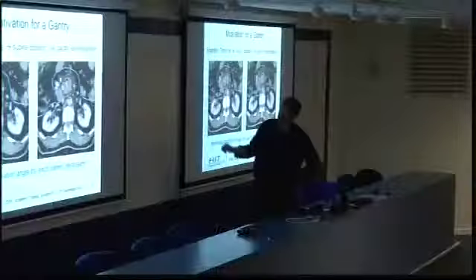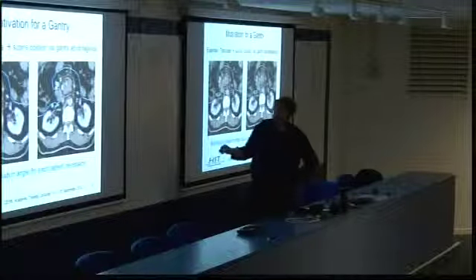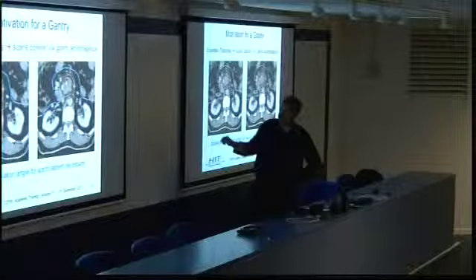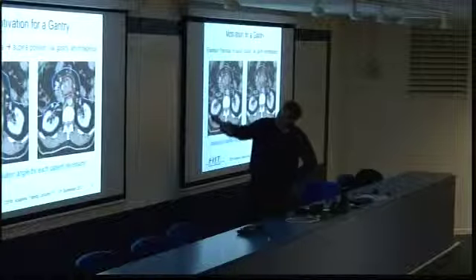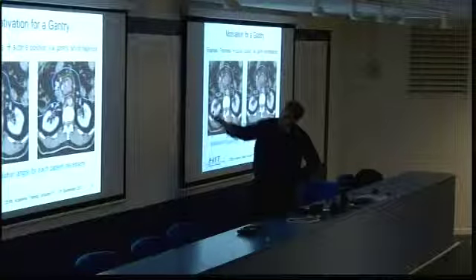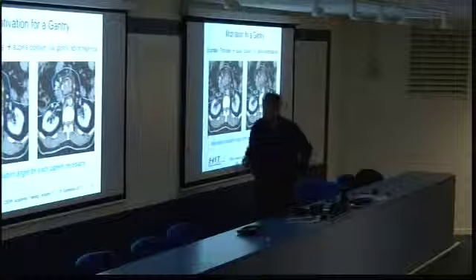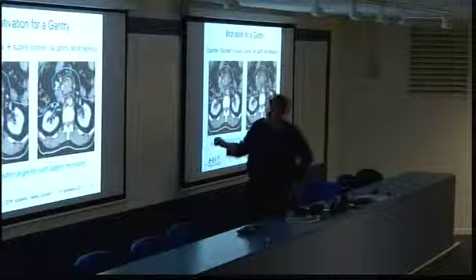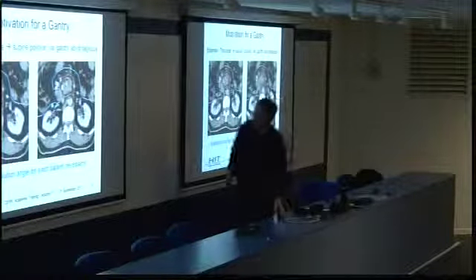If you want to go with the beam directly to this position, then you would cross the spinal cord, which is not a good idea. Then you have other organs. There is only a very small channel where you can go to such a tumor. And clearly, as everyone is an individual, you need individual irradiation angles for such patients. This is one motivation, not the only one.